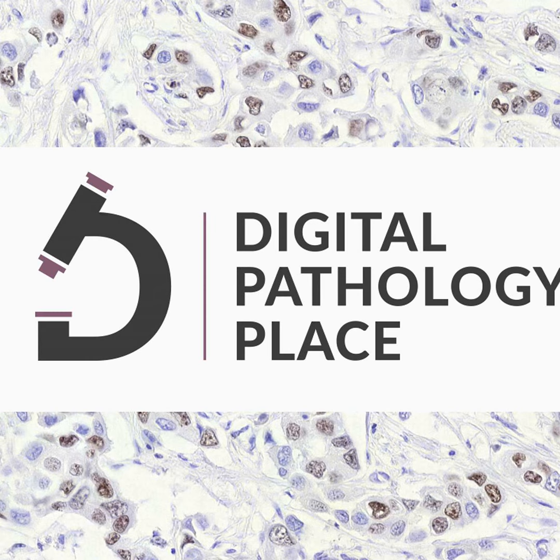And as I already told, my supervisor's first Nature paper in 2016 showed that deep learning could directly predict mutations. Directly from the whole slide images, you could predict mutations. So the idea we had was to combine both these studies, to use swarm learning as a technique and show that deep learning can predict mutation. What we wanted to show in our hypothesis is that by having three different cohorts on three physical systems, the performance on an external validation cohort should not drop compared to a centralized model. The swarm learning model should perform on par with the centralized model. So this was the hypothesis, and this is what we tried to achieve in this whole study.